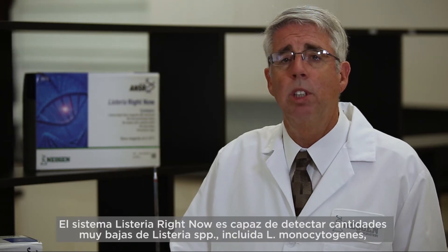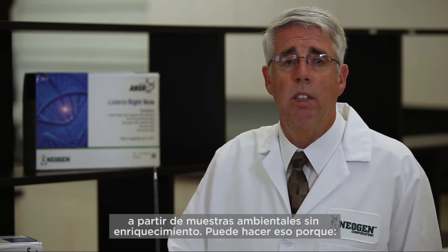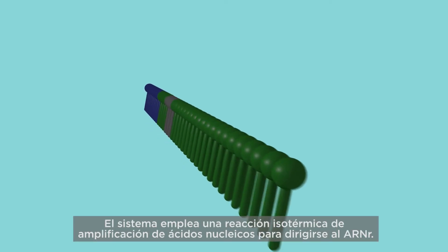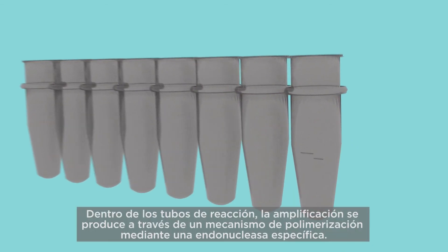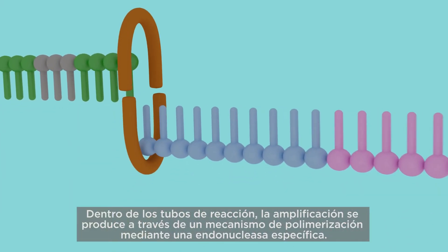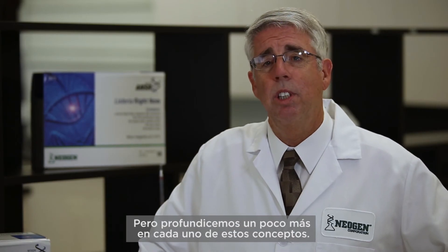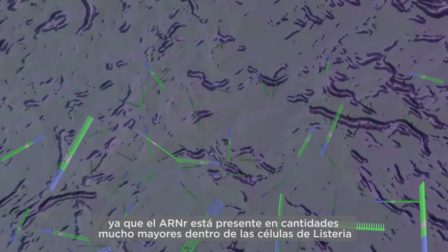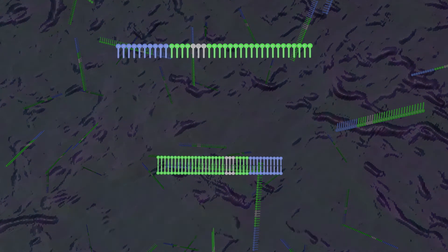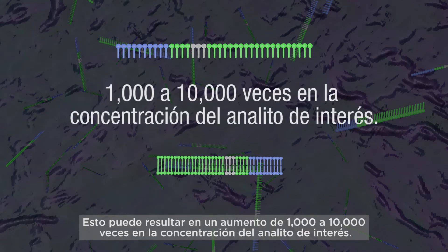The Listeria Right Now system is able to detect very low numbers of Listeria species, including L. monocytogenes, from environmental samples without enrichment. It can do that because the system employs an isothermal amplified nucleic acid reaction to target ribosomal RNA. Typically between 1,000 and 10,000 copies of the target are present in Listeria cells compared to only one copy for DNA, resulting in a 1,000 to 10,000 fold increase in target analyte concentration.